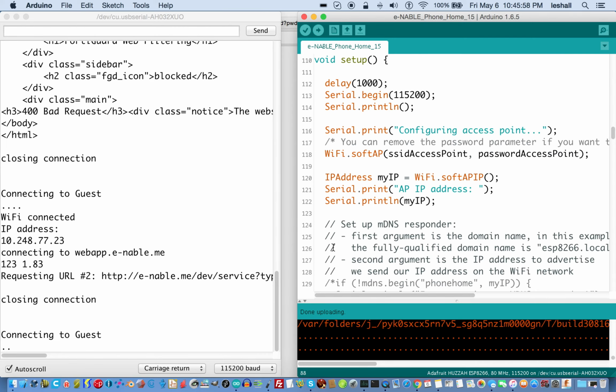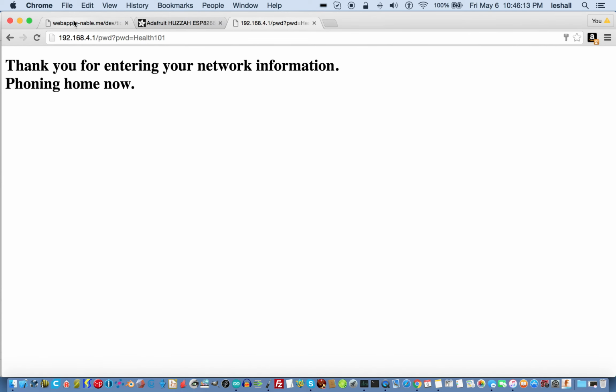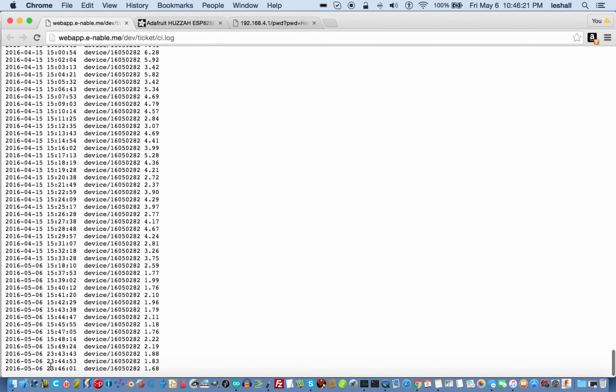I have the timing. The timing interval is 60 seconds, yeah. So every 60 seconds, when I reload it, it is going to have another entry, 4453, 460, there's the 4342. Okay, this is our device number, which is built into the chip. Each chip has a unique device number, or supposedly does. And this is the battery voltage.